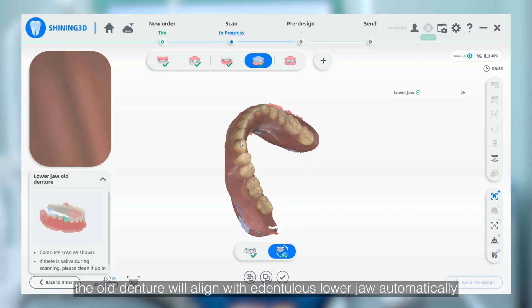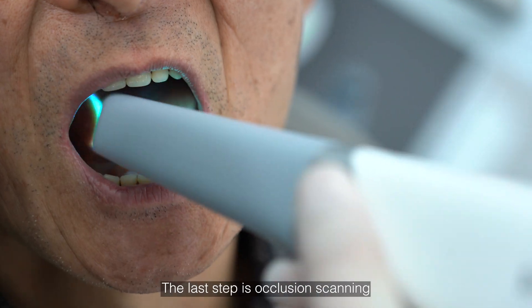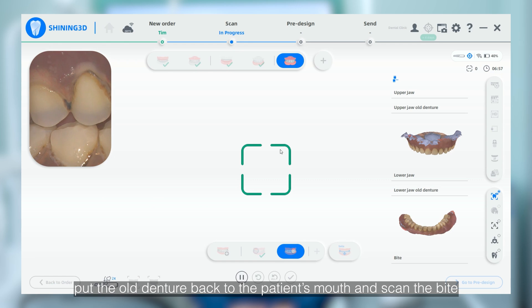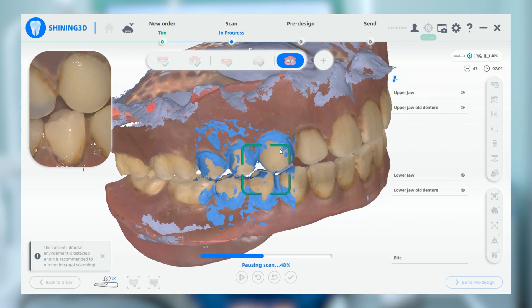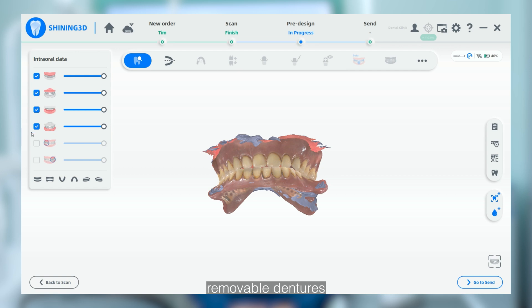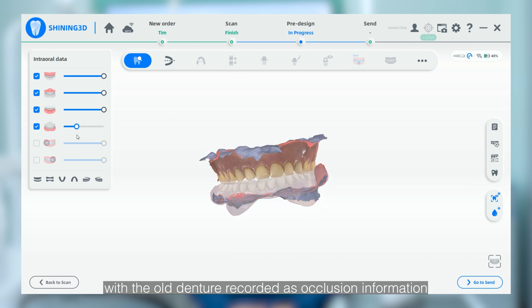After that, the old denture will align with the edentulous lower jaw automatically. The last step is the occlusion scan. Put the old denture back in the patient's mouth and scan the bite. Now we have finished the entire workflow of scanning removable dentures, with the old denture recorded as occlusion information.